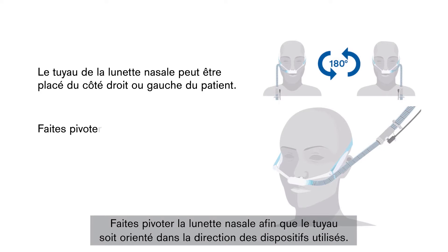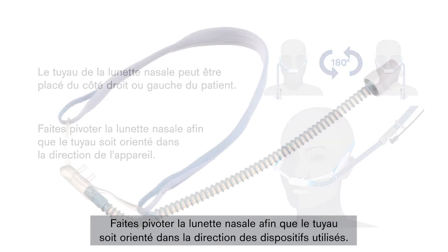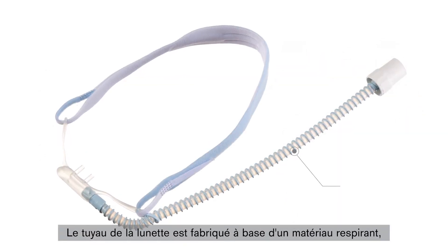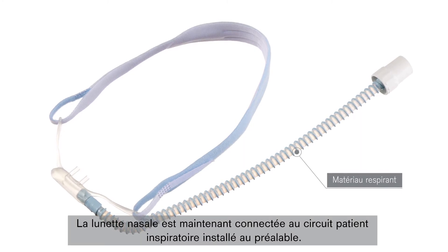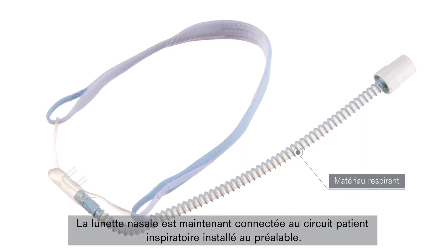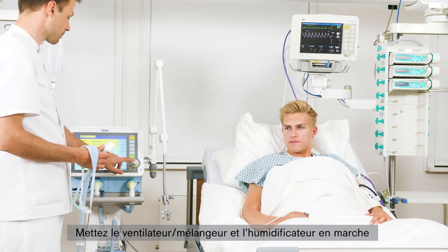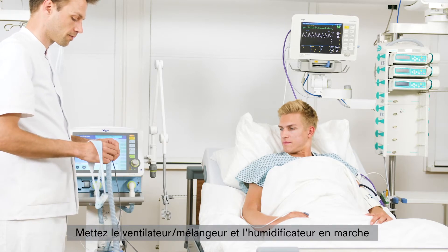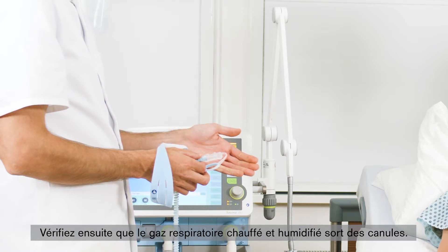Turn the nasal cannula so that the nasal cannula hose points in the direction of the given devices. The nasal cannula hose is made of a breathable material that minimizes the formation of condensation. The nasal cannula is now connected to the previously mounted heated, inspiratory breathing circuit. Put the ventilator or blender and the humidifier into operation and set the necessary parameters. Then check that heated, humidified breathing gas is coming out of the prong.